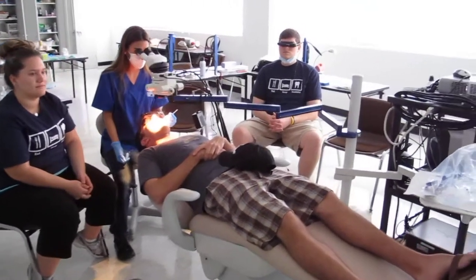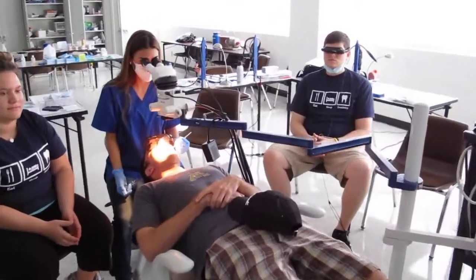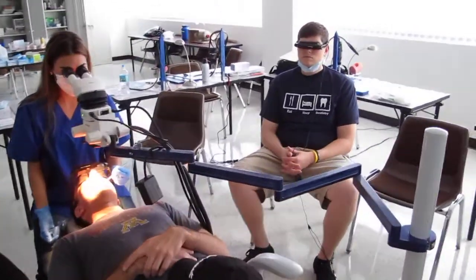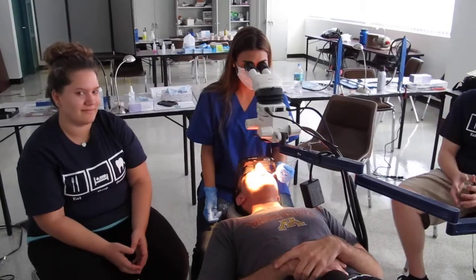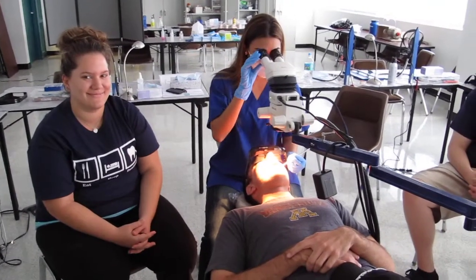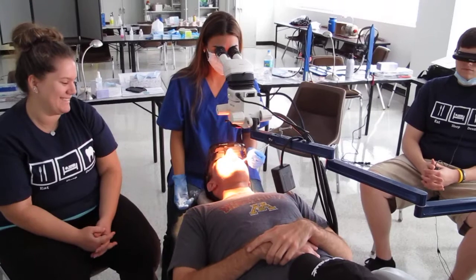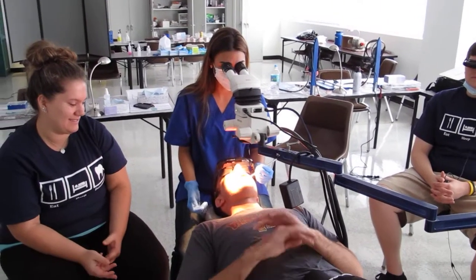I'm just going to zoom in over here. We have our students Matt, Lida, and Mary. And we're here with Paul in the chair — he's our demo patient.